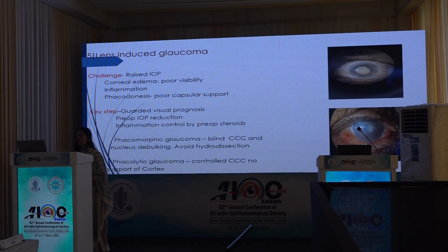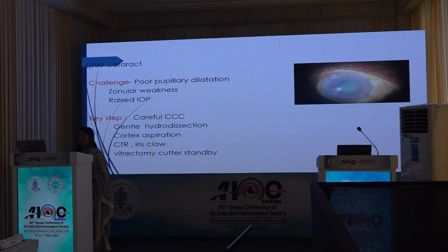In phacolytic glaucoma, the controlled CCC should be done with the Utrata forceps because there is no cortical support. In cases of PXF cataract, the challenge here is the poor pupillary dilatation and zonular weakness. There can also be raised intraocular pressure.